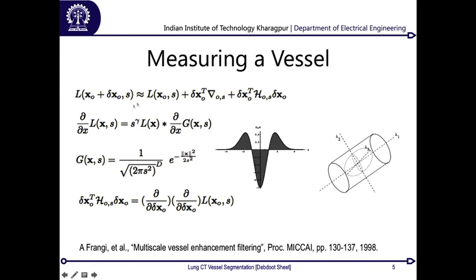Now, where this scale comes from is, say you have a whole volume, about 30 centimeters cross 30 centimeters cross 30 centimeters. On the digital space, when I am digitizing this into 512 cross 512 cross 512, my resolution boils down to 30 centimeters divided by 512 along each dimension of space.